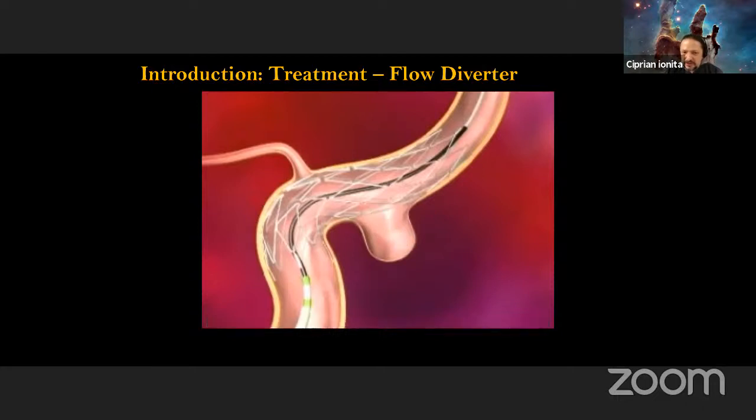The issue with undersizing and crunching it together is that, if you're not careful when you push onto the device, you will end up buckling it into the aneurysm neck. So it requires a lot of finesse for the neurosurgeons to feel the pressures in the catheters and the backflow to avoid this kind of complication. Others want to be safer, and they're saying, I don't want to fully occlude this, I just want to make sure it's not going to grow.